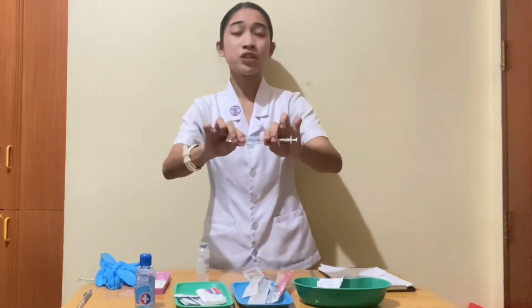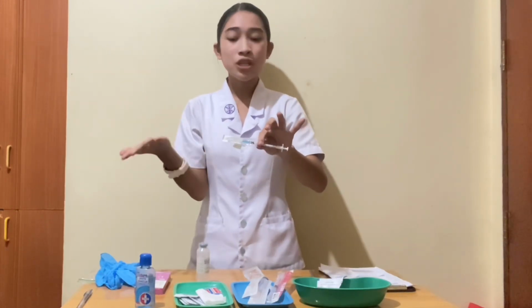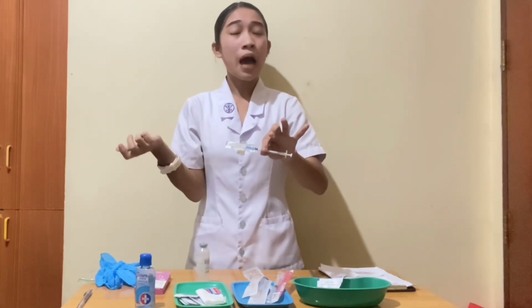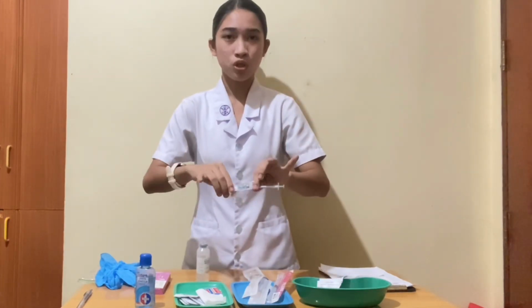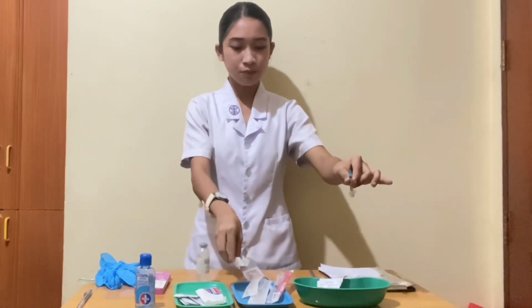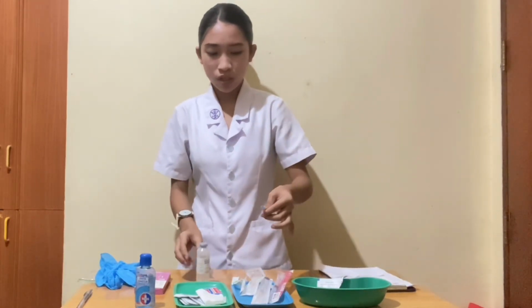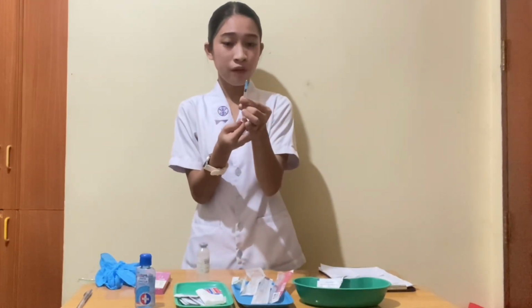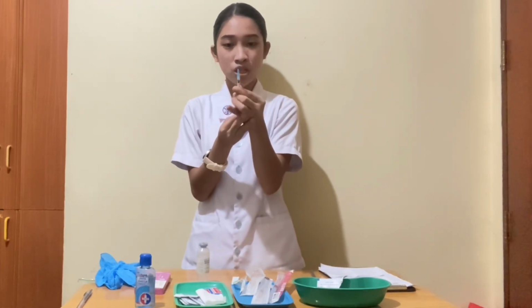Then after that, we're going to remove the cap of the needle. Then draw up into the syringe an amount of air equal to the volume of medication to be drawn. I'm going to open it like this to avoid breaking. I'm just going to draw up an exact amount of air, which is 0.1 ml, for the sterile water for intradermal injection.